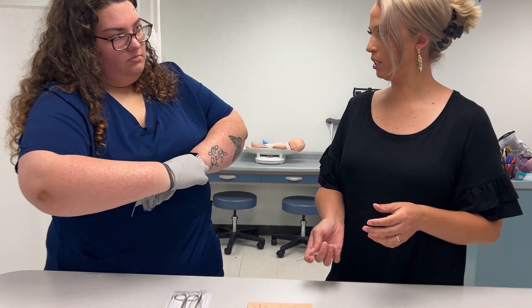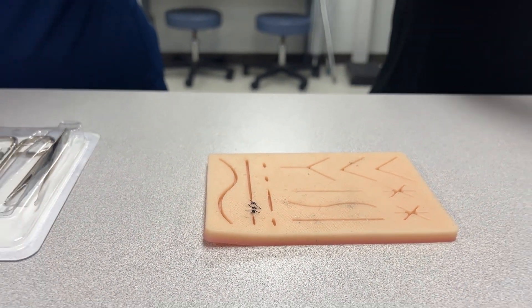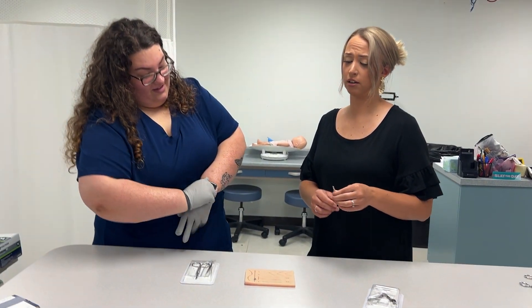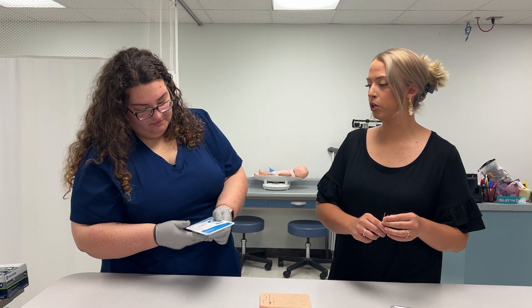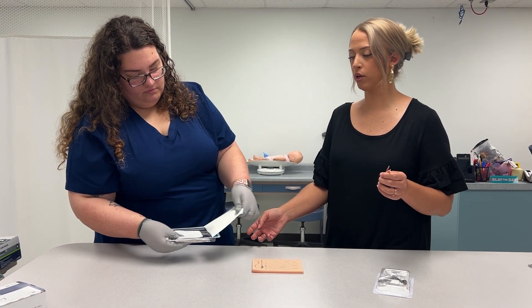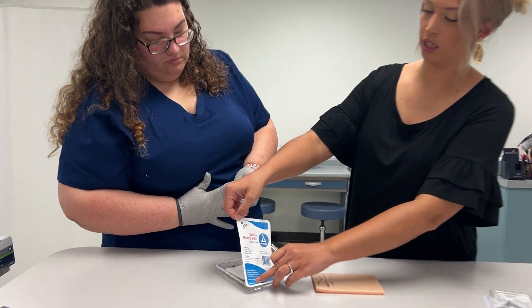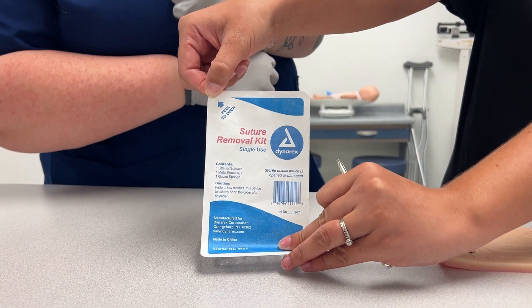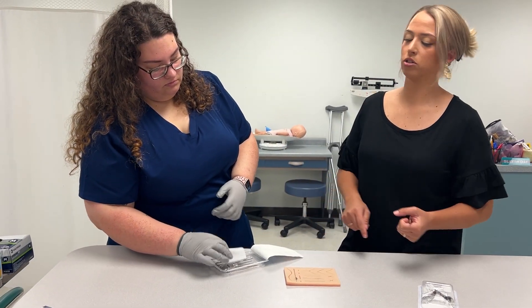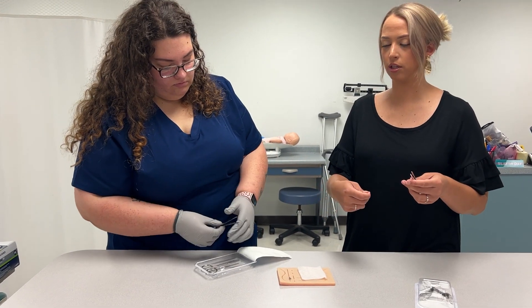Our patient has three stitches today, so Kylie is going to put on her gloves. It's humid in here, so we're going to open up a new package. These are called suture removal kits — they are single use, so you just throw these in the sharps container when you're finished. Go ahead and set your gauze over here; we're going to use the gauze to set our stitches on.